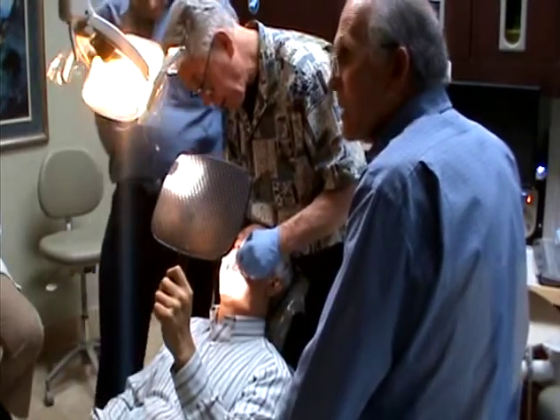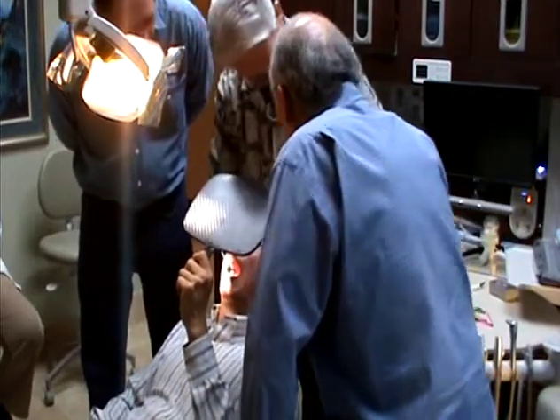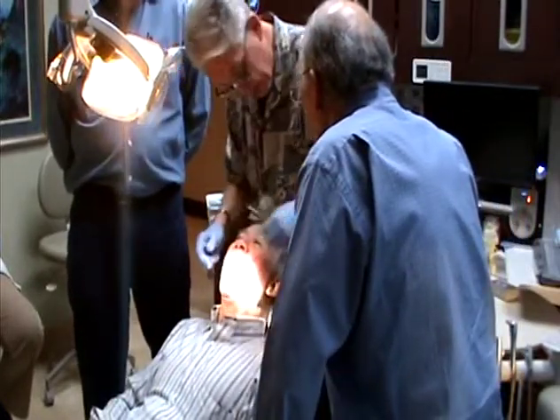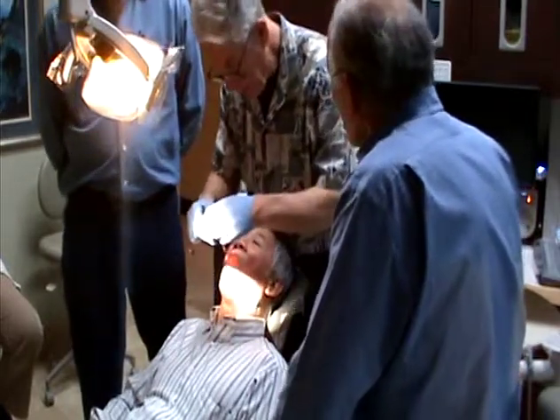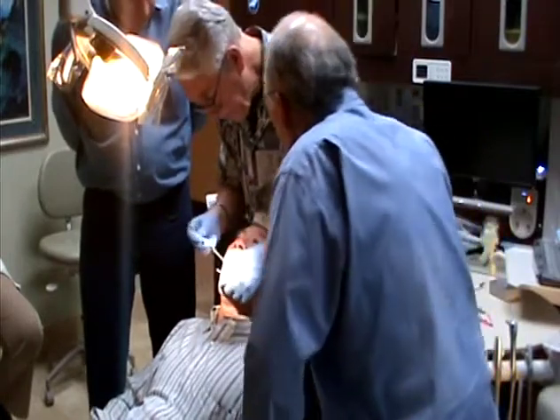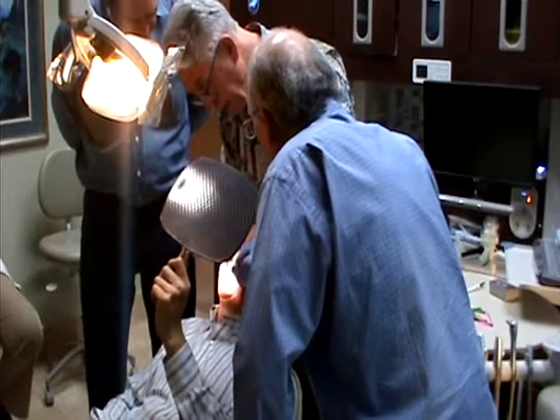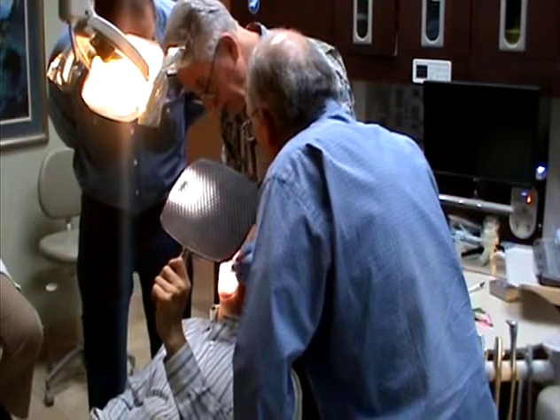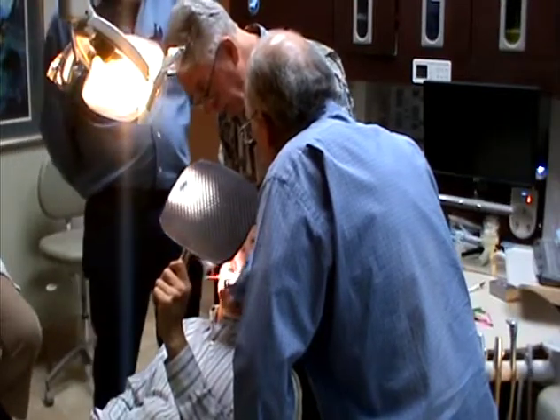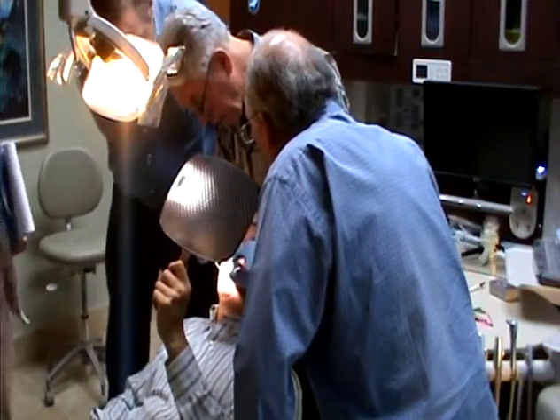Now he's getting heavy. You see, not only is he just heavy here, you had it here, here, and here. Went down the line there. But don't bite, let me tap it for you. So that's the lingual cusp of the first molar going across those lower lobes. Now you've got three nice contacts right there in center. And we want to make sure when he slides, he's not riding up these inclines in here.